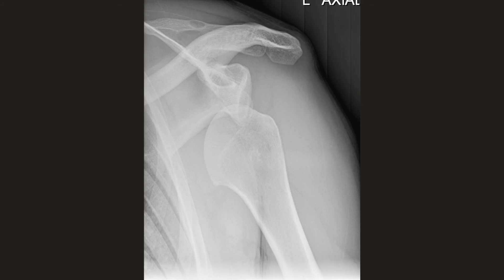This is another example of an anterior dislocation. You can see how a Hill-Sachs defect may occur, as well as a bony Bankart or soft tissue Bankart lesion.